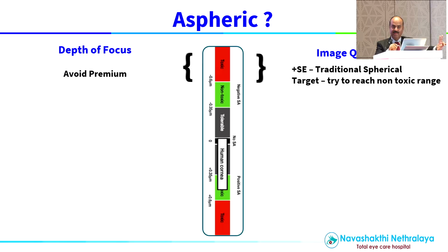Now what are the two values that we have to take home? One of them I said, if it is image quality you are concentrating on, leave this patient with a spherical aberration of 0.1. That is, you are using a trifocal IOL, you are using some kind of spherical aberration. Look at the cornea, do not go by the company. Look at the cornea, look at the spherical aberration and match it to this. This is what I am doing of late. I have 3 different trifocal IOLs.